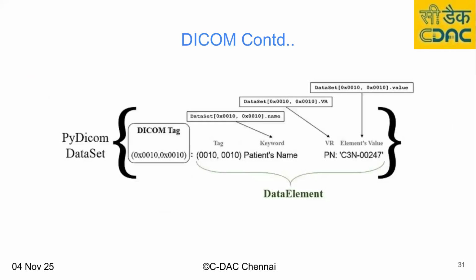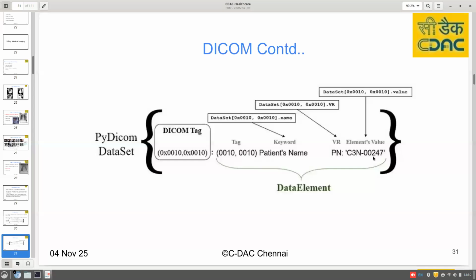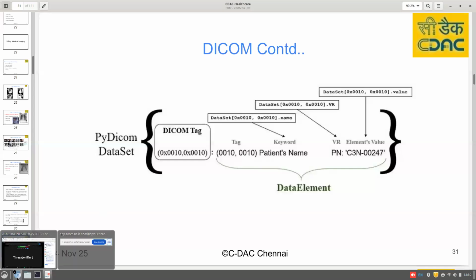So DICOM is actually a format where the parameters related to X-ray can be represented in the form of tag, keyword, and value pairs.